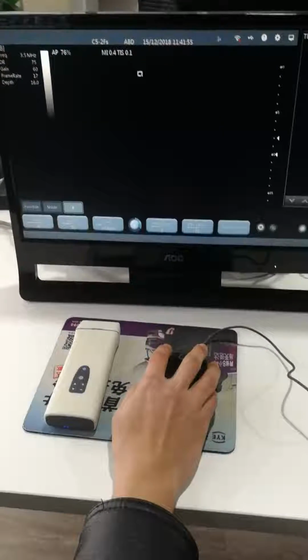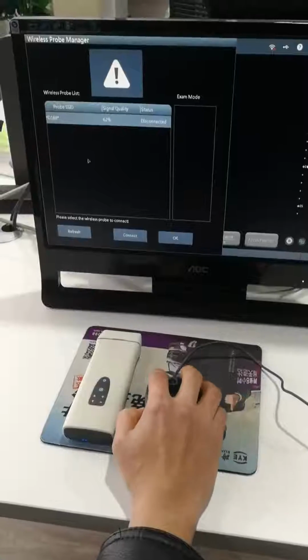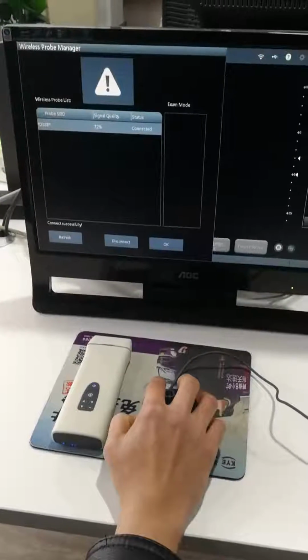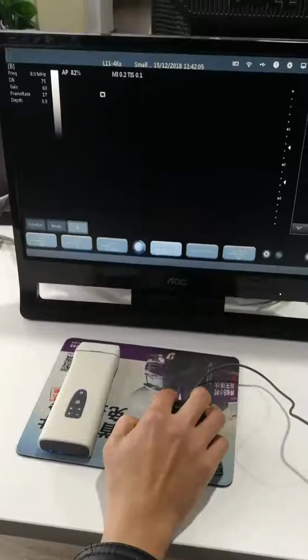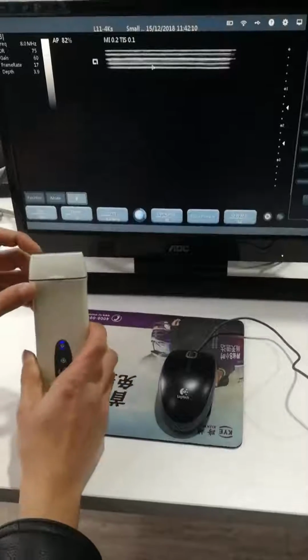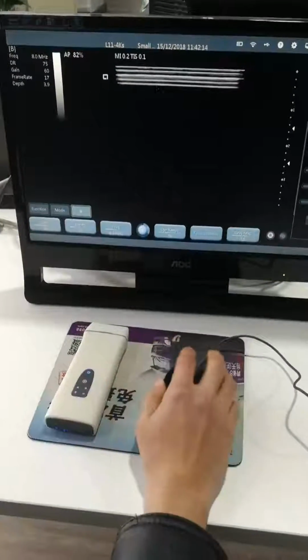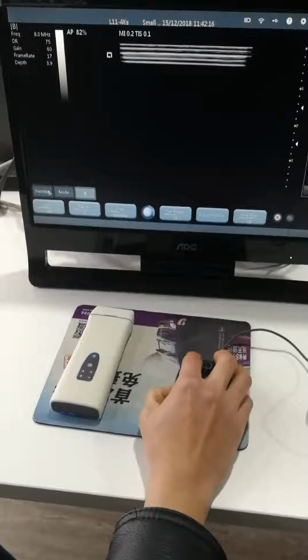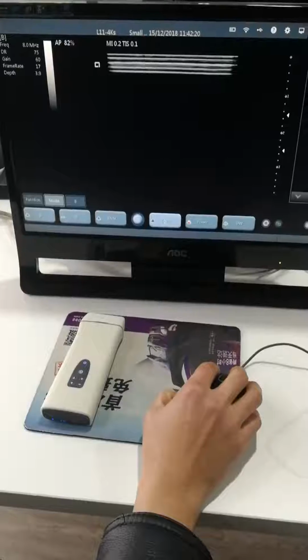Now I'll show you how to connect our wireless ultrasound probe. This is the serial number. You just connect it to our Windows PC. And now you can move to other modes such as the color Doppler mode.